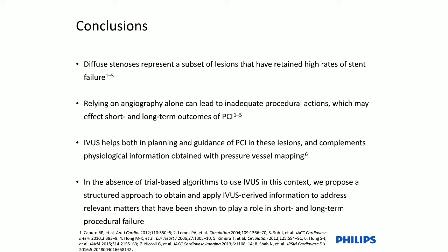Again, the algorithm that we propose tries to integrate as best as possible the information that has been obtained in the individual trials in a pragmatic fashion. We did not want to give fixed recommendations regarding any of the criteria that have been proposed for obtaining maximal expansion.